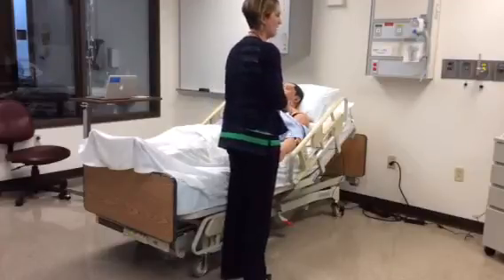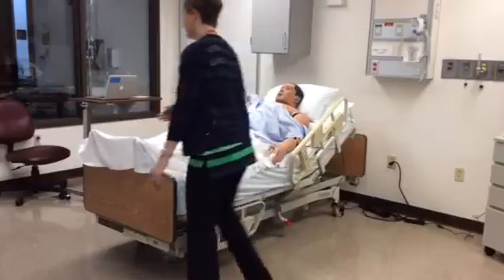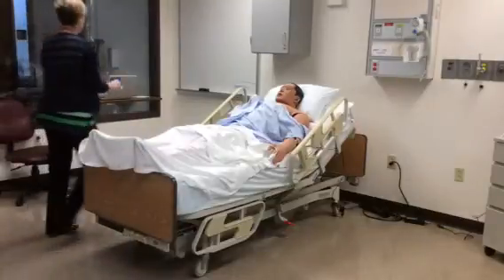Oxygen you have in your blood. Looks like it is 95%. That's good.